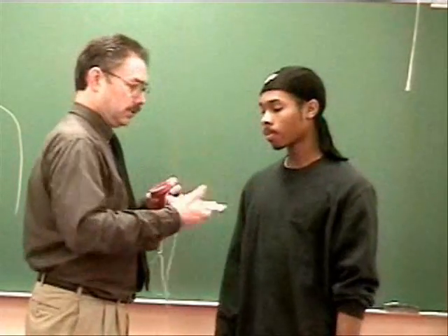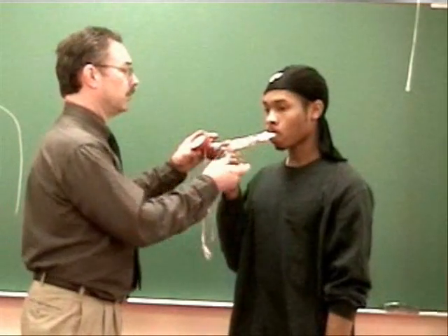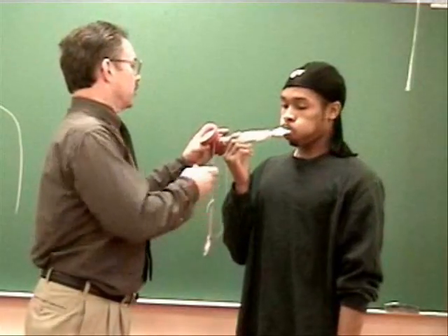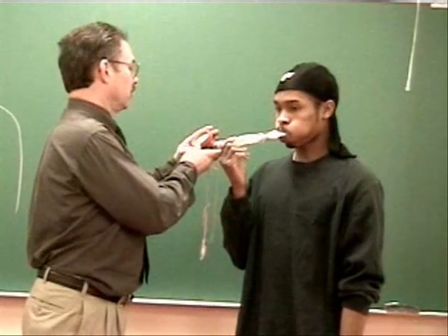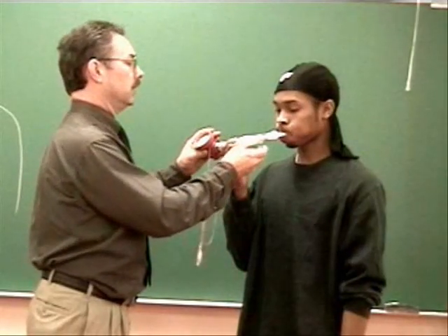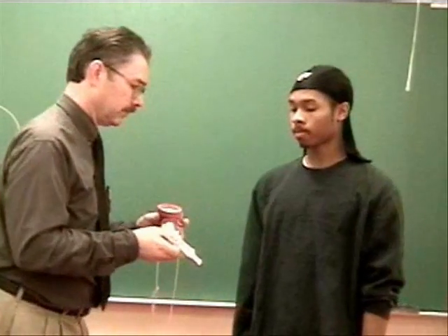So go ahead and, just a second, let me turn that. Put that in your mouth. Big breath in, deep. Bigger, bigger, bigger, blow it out. Now push out, keep pushing, pushing. Keep going, keep going. And let it, good, take a breath. Okay.